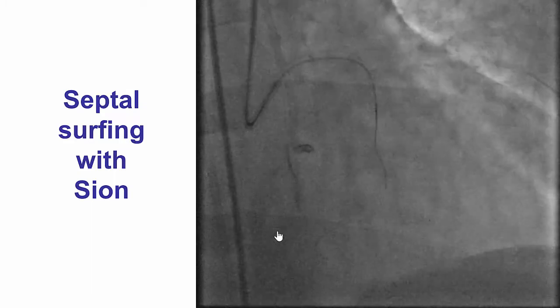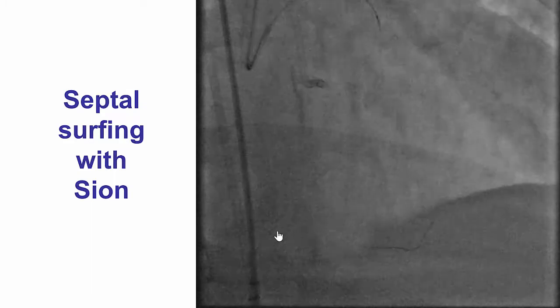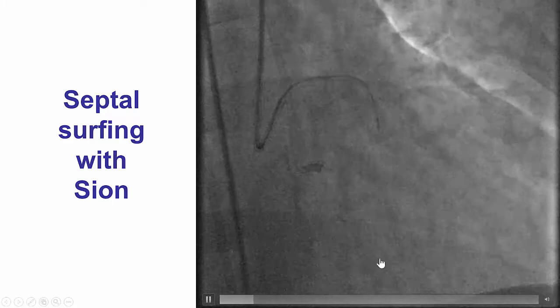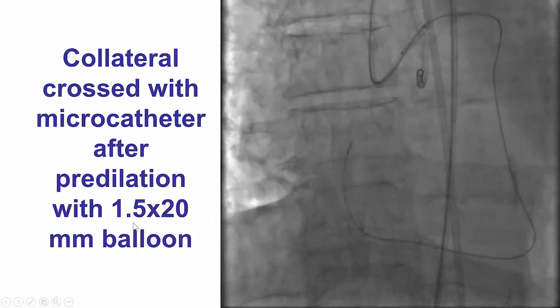There's a controversy whether the septal is better, surfing is better, or whether contrast guided is perfect. There's no really perfect answer, but if surfing works, it can be a very time efficient way. As you can see in this particular fluoroscopy, crossing happened within less than 1 minute.